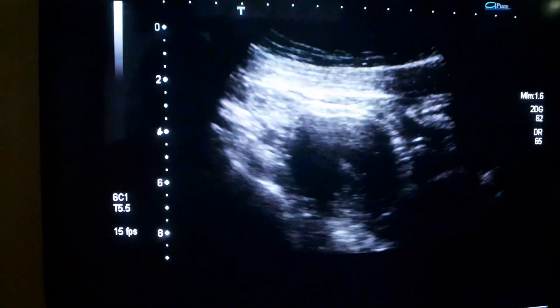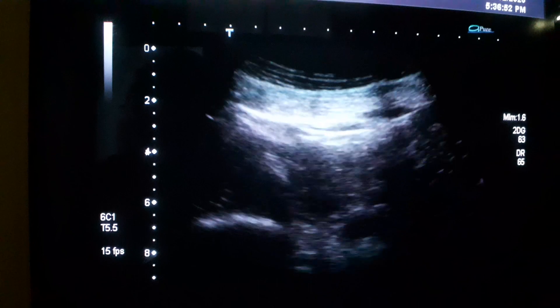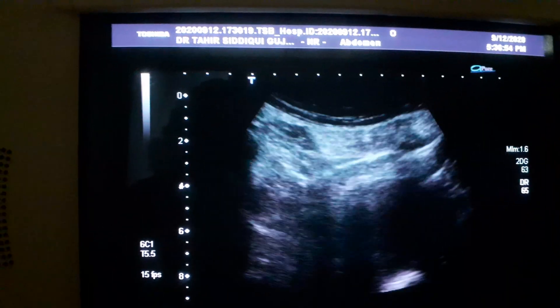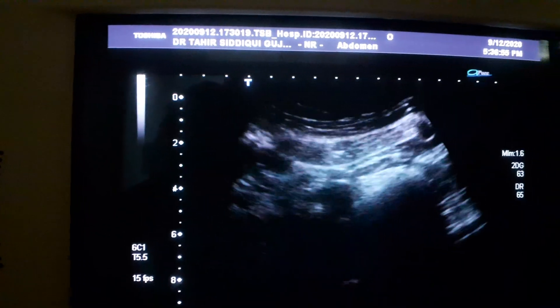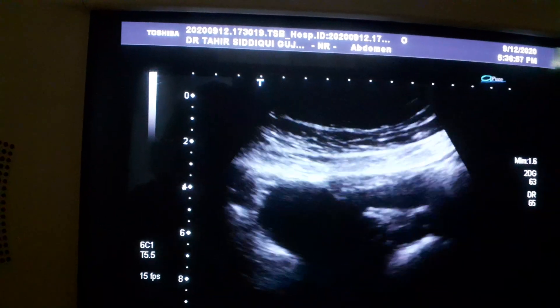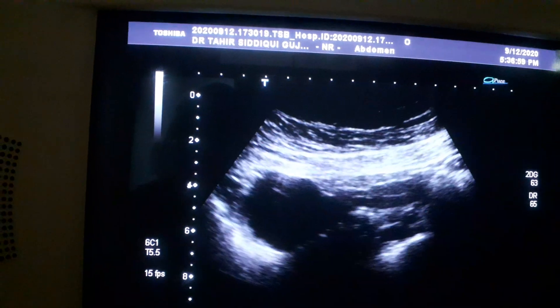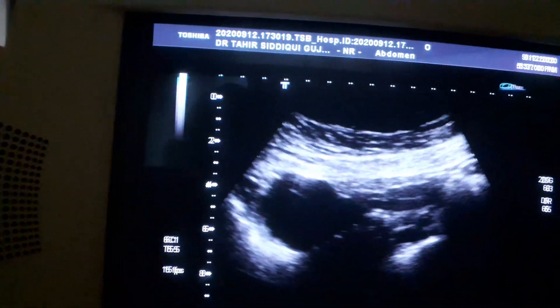So this is our case to show you how a paraovarian cyst is visualized or seen on ultrasound. Thank you very much.